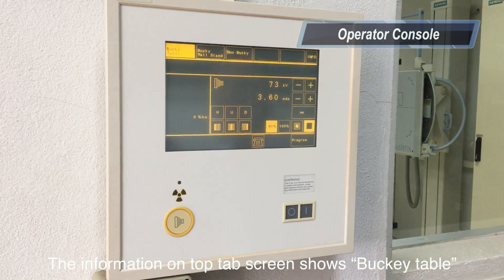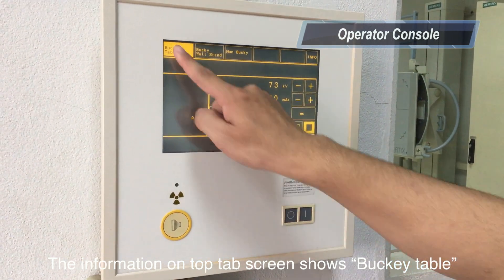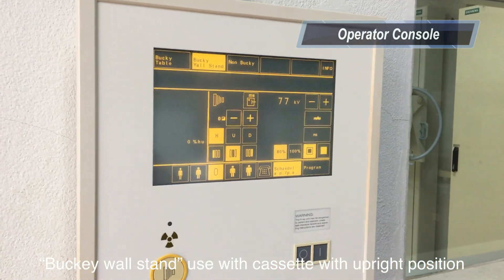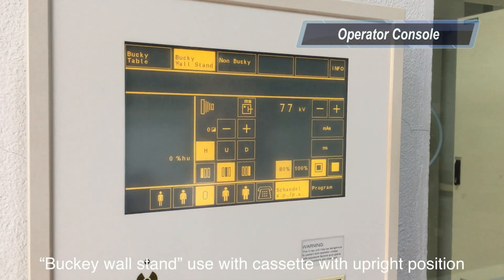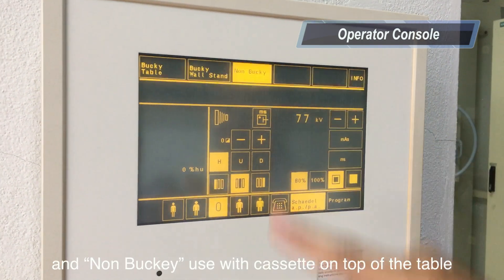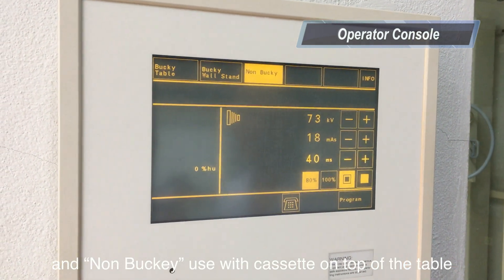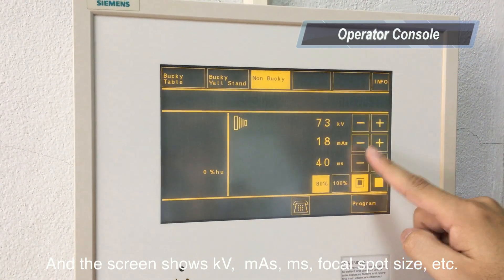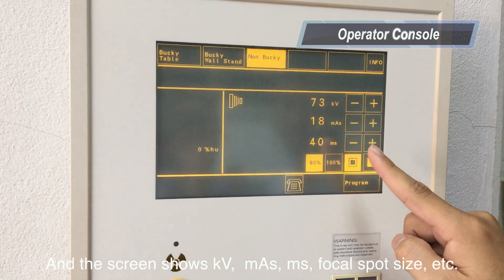The information on the top tab screen shows: Bucky table, use with cassette under the table, Bucky wall stand, use with cassette in upright position, and non-Bucky use with cassette on top of the table. The screen also shows KV, MAS, MS, focal spot size, etc.